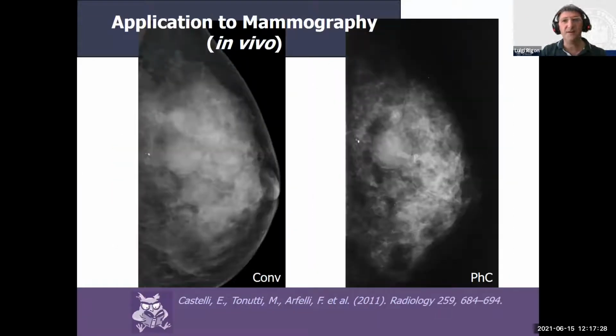I also now want to show a couple of slides from an experiment that we did from 2006 to 2009. This is an application of phase contrast to mammography, and it has been performed here in Trieste. Here you have a comparison of the same patient at the conventional system and at the synchrotron: here without phase contrast and here with phase contrast.